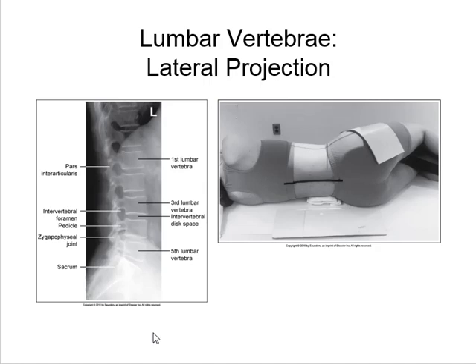So how you find the spine is if you can see this bright area right here. That's the very peak of the iliac crest. If you can find the top of the iliac crest and put your longitudinal line of collimation going pretty much straight up and down that, your spinous process is right back here.